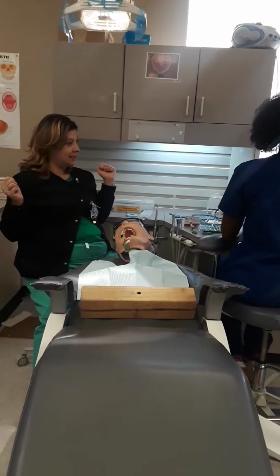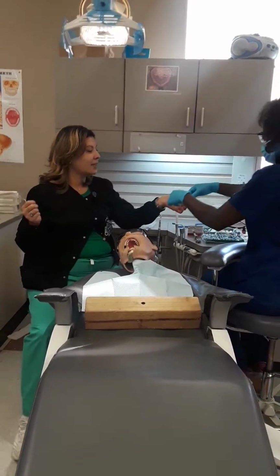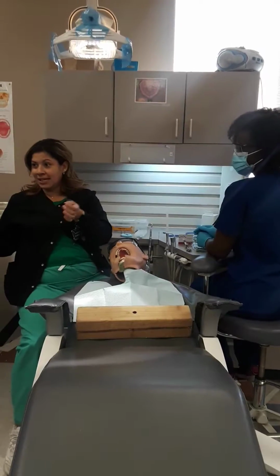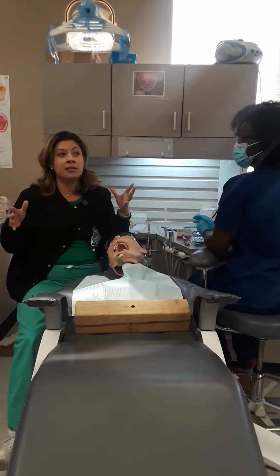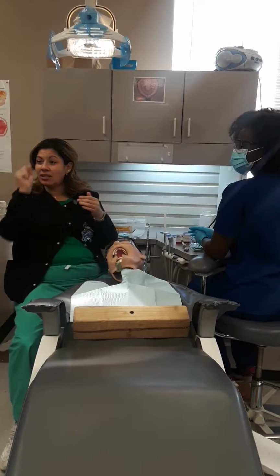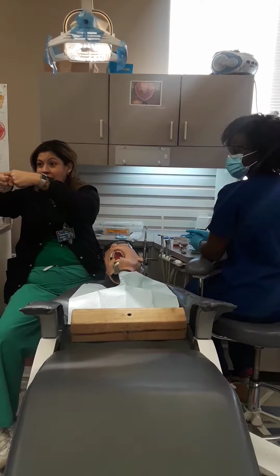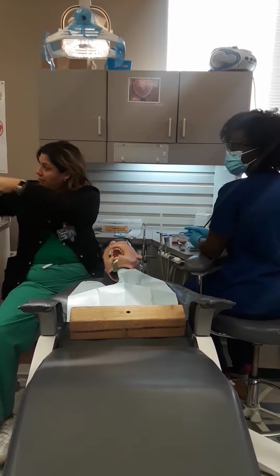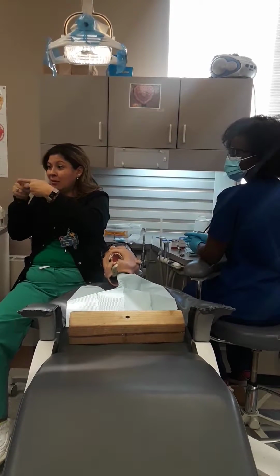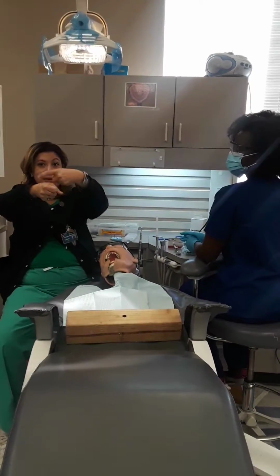Finishing strip. We got that. I'm going to pass that around. So if we have any proximal surface, what are they again? Mesial and distal. If our proximal surface is missing and we have material that hangs over, like this is my tooth and I have material hanging over against my hand, I'm going to take my finishing strip and take whatever was hanging off and make it even. So that's all it's going to do, make my margin even.